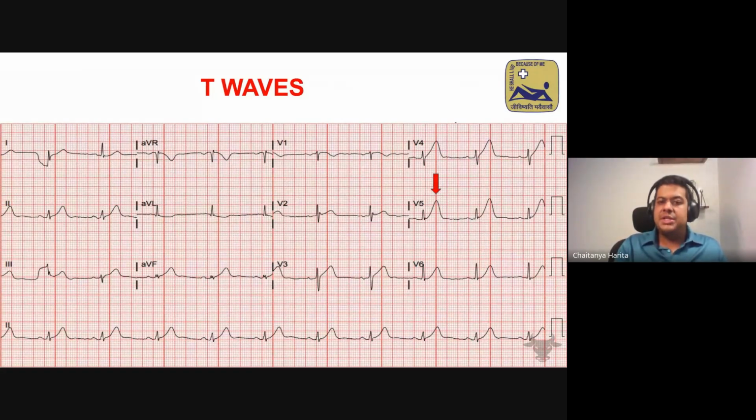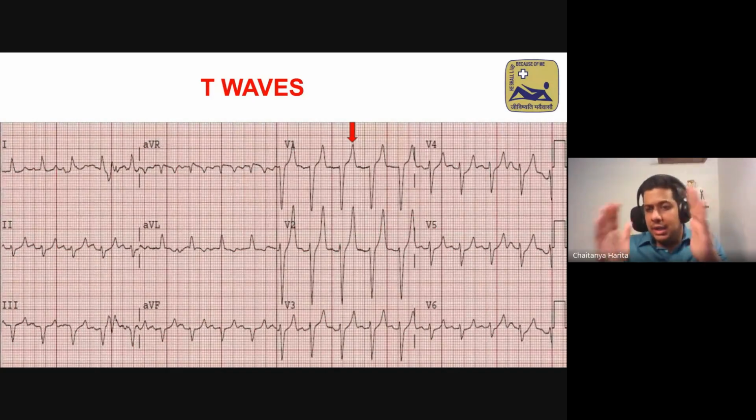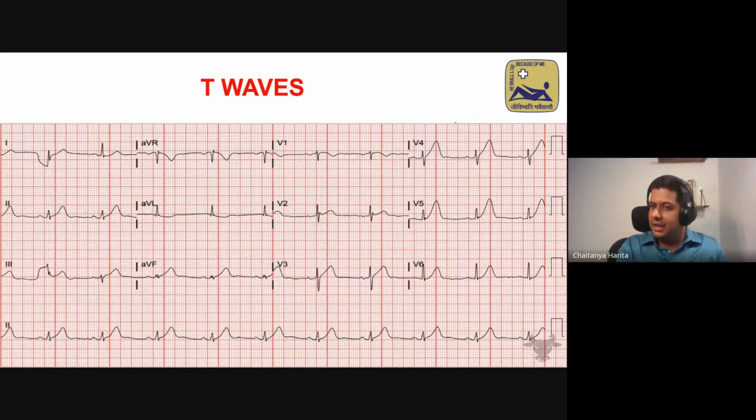If the patient is having ongoing chest pain, repeat the ECG and refer them. And there are 5 or 6 occasions that I can remember where I have unfortunately been right. It has turned out to be an MI, but we've saved the patient purely because you are able to identify it. So never misread or overlook a T wave. If the T wave is tall and symmetrical but wide based, it could be evidence of acute MI. Tall, symmetrical but narrow based, hyperkalemia is your most likely diagnosis.